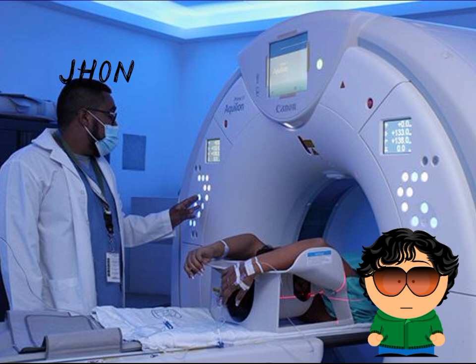Single photon emission computed tomography, SPECT, is similar to PET but uses different types of radioisotopes. Optical tomography uses infrared light to obtain images of tissues, often used in ophthalmology.